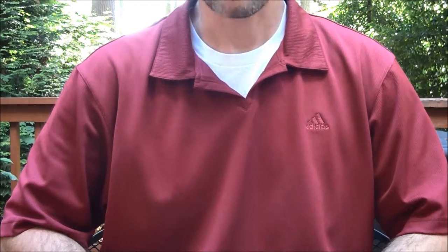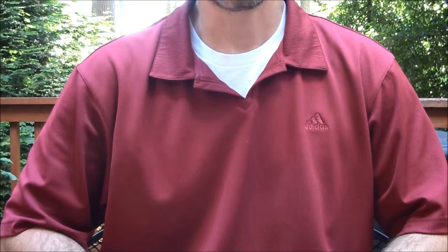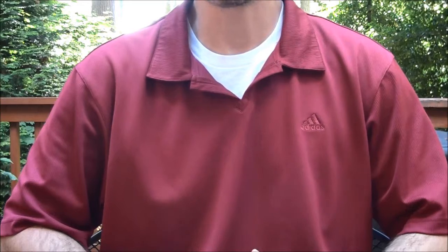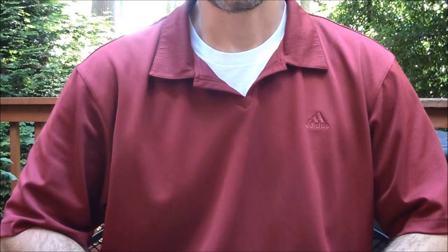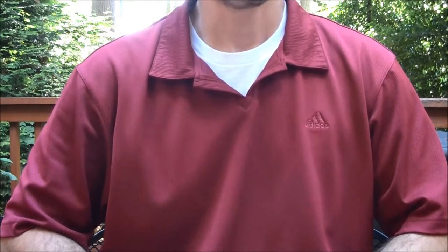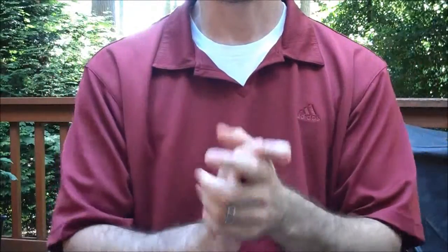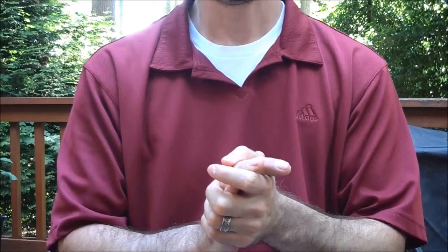We have a couple of them, but the easiest one to describe to start with is a choice-based communication system where we're providing choices and letting Jay choose. For example, yes/no questions. It's essentially using my two hands as the choice identifiers, and then letting Jay choose with eyes which choice.